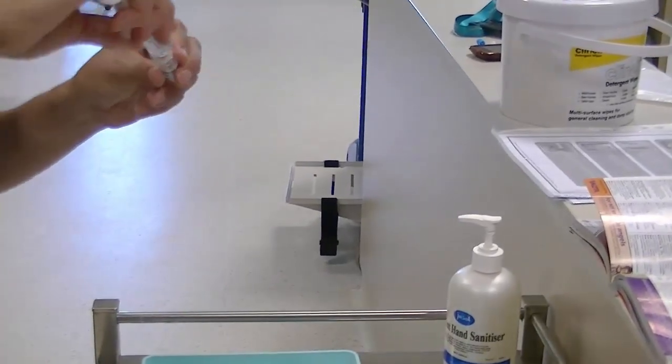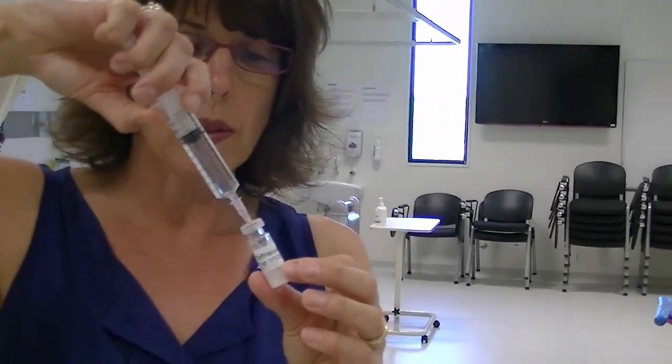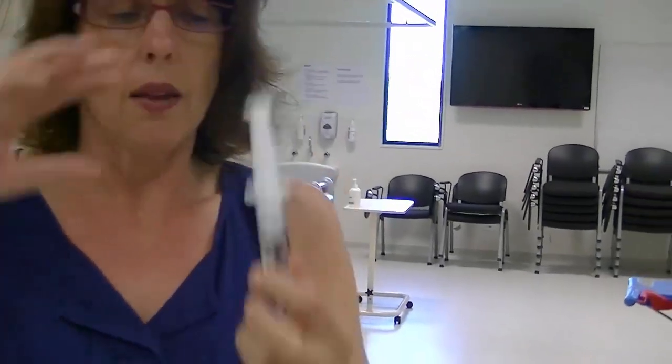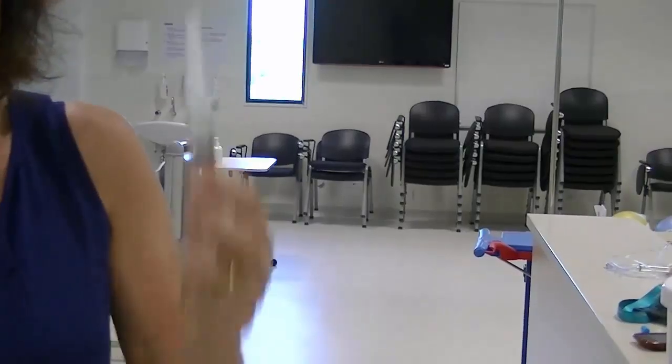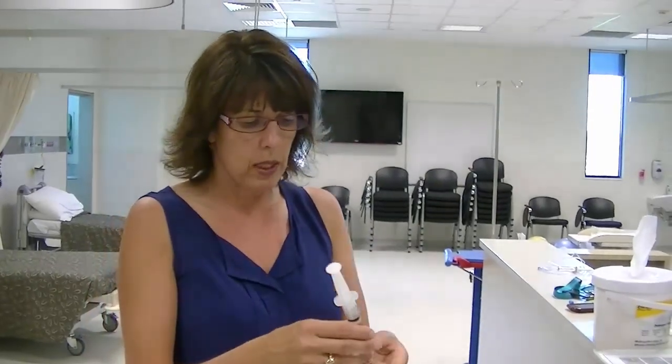I will inject some fluid into the vial. It's not going to fit 10 ml, so I'll just put a couple of mils in and then I will shake to dissolve. Drugs should dissolve to completely clear. They might be tinged yellow. The information books such as MIMS and the AIDH will tell you if they are a little bit discoloured when they're fully dissolved.